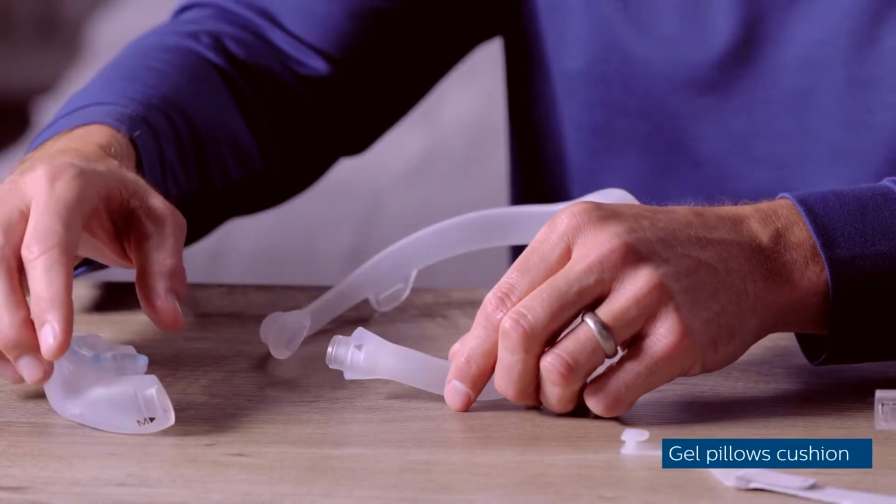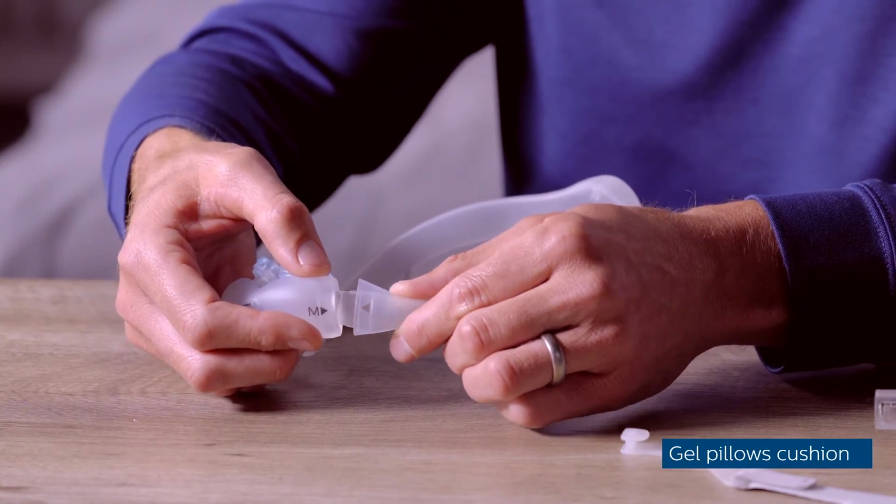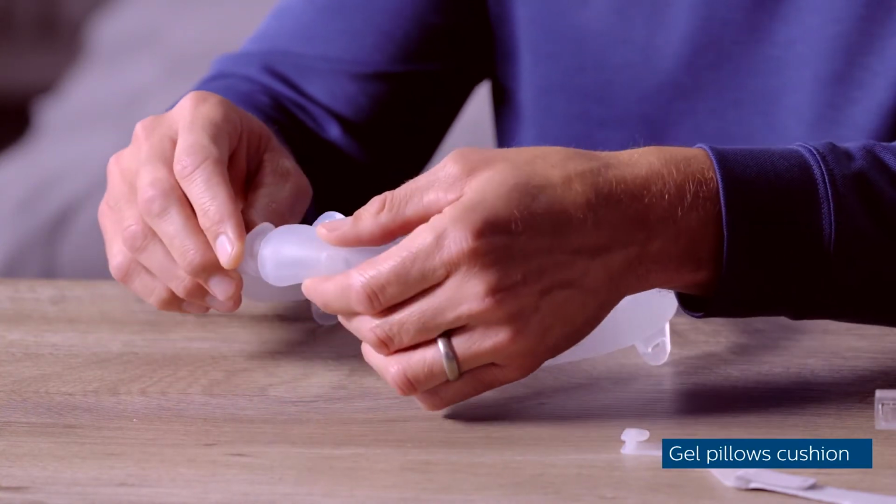The gel pillows cushion attaches in the same way. Align the triangles and press the cushion into the frame until it clicks into place.